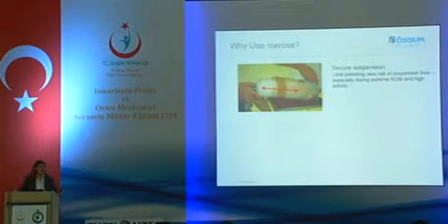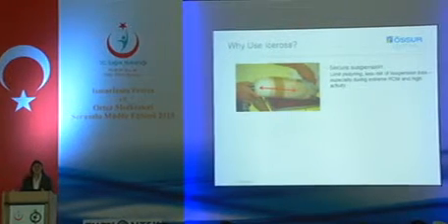As we know, when we change activities or have extreme ranges of motion, our musculature also changes shape. So the liner will follow the musculature change as well as maintain that suspension method.